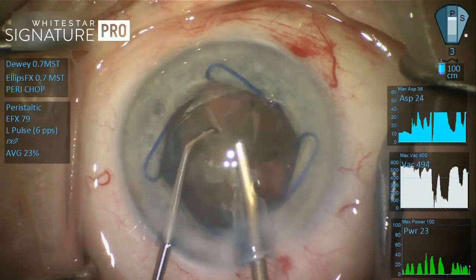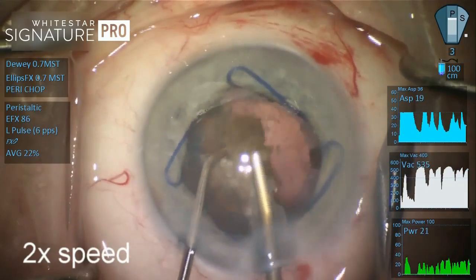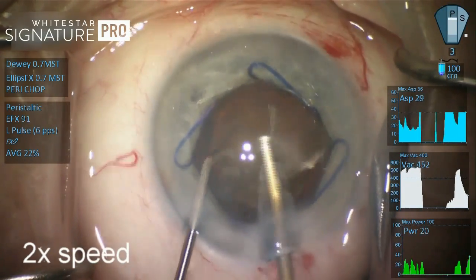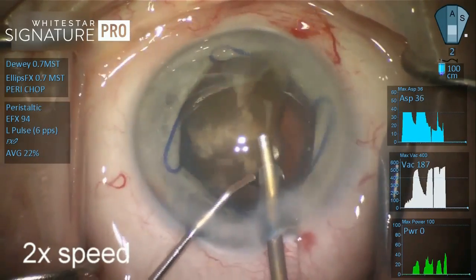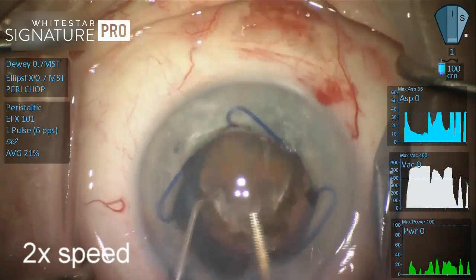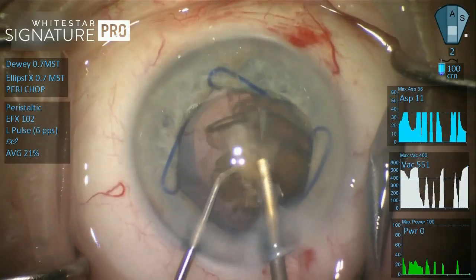No chamber instability, no repulsion, no chatter, no turbulence, no stray fragments bouncing off the endothelium. Now, as you watch, you'll see that the nuclear material rotates on the tip of the needle, and that's because the Dewey radius tip doesn't have any sharp edges. Now, the advantage of not having a sharp edge is it doesn't penetrate an intact layer. So it is basically stripping this material off the lamellar structure and emulsifying it beautifully with the application of vacuum and power.